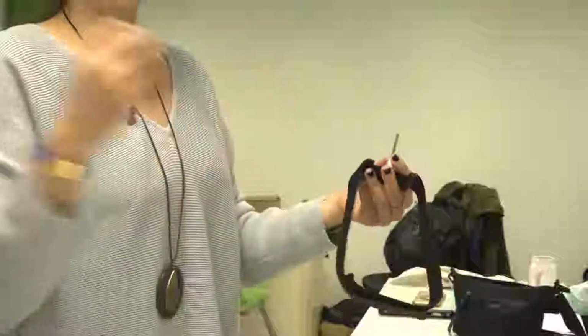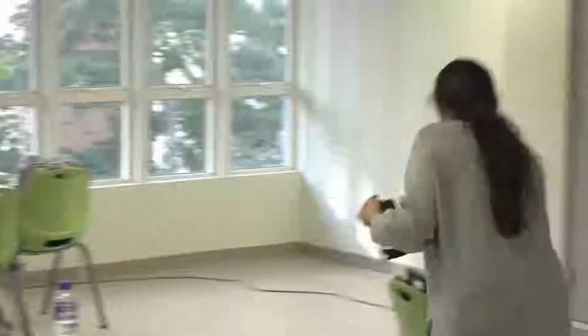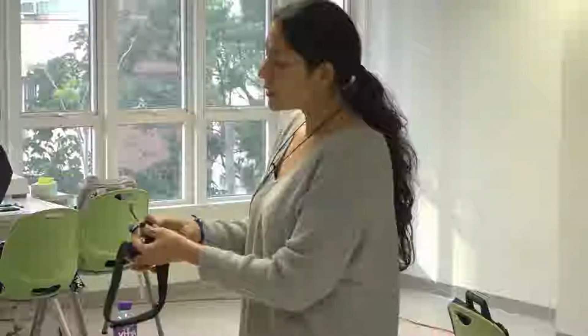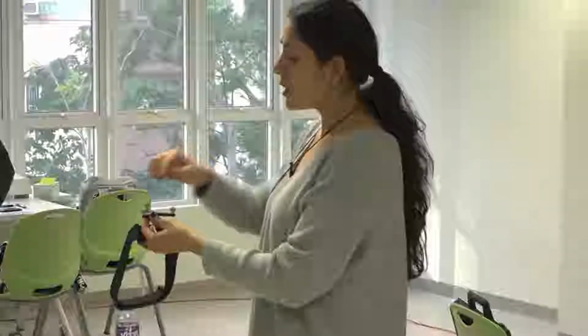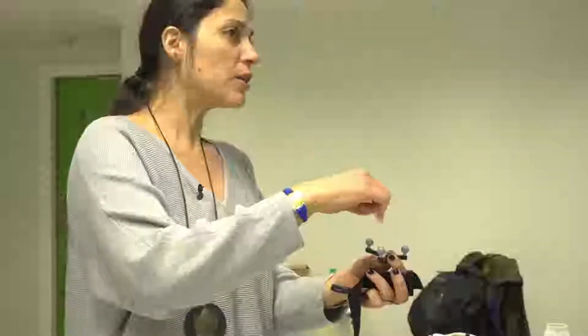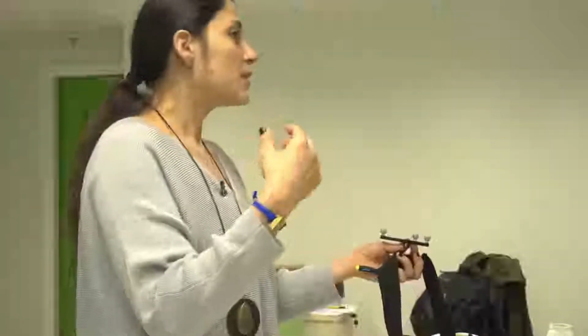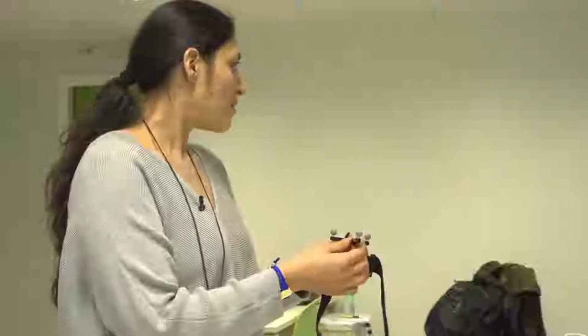Yesterday we did it, but I didn't want to damage the sensor. These sensors are very, very delicate. Yesterday I was doubting whether to leave everything ready for tomorrow or remove it. The problem is that they are very delicate, and if you don't treat them with care, they will start to be scratched and will not work anymore. You don't want that, so just for the sake of taking care of the equipment, I put it back. That's why they are not ready now.